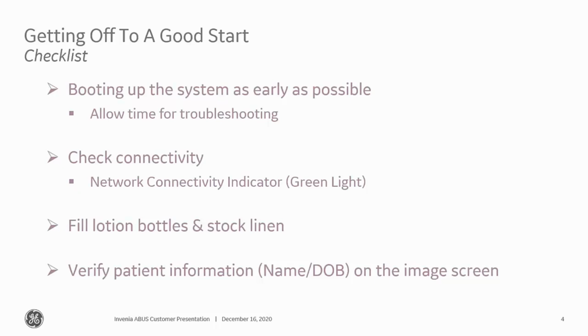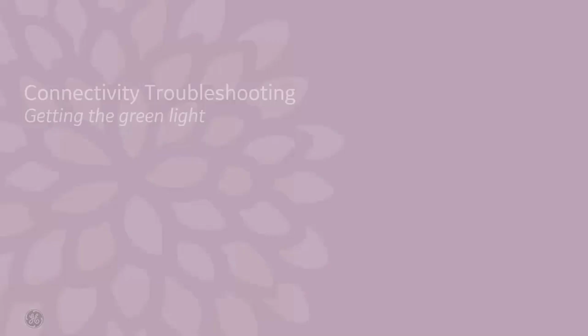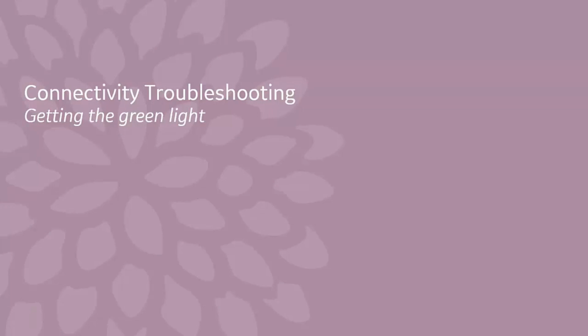We cannot change that information once you take one scan. That patient information is locked in. So make sure you've got that patient. With the touch screen you can sometimes accidentally hit the wrong patient, so just confirm. Can't overemphasize that.